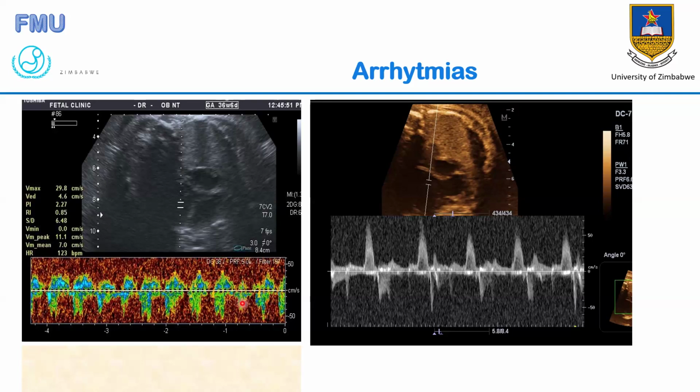Another ectopic. There is an ectopic interrupting here again. An ectopic will excite the atrium because these are atrial ectopic beats, which we are seeing in this case. But an ectopic may not be strong enough to cause the ventricle to contract. This is why you see just a small waveform here. Then we have another atrial, we are back to normal atrial ventricle. Intermittent ectopics, as long as the heart rate is normal, do not harm the baby. They only harm the baby if they interfere with their heart rate.